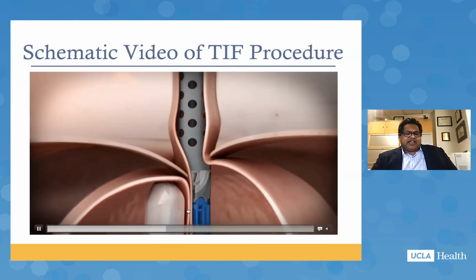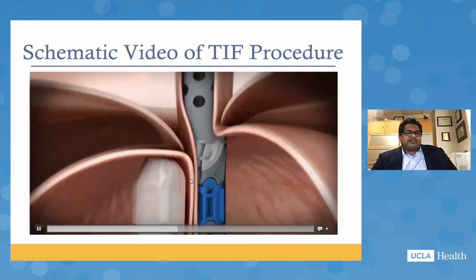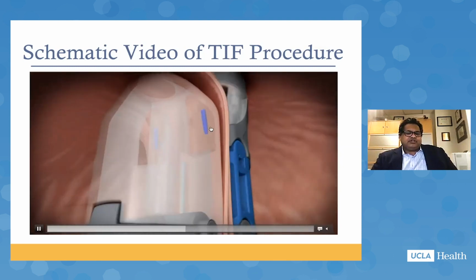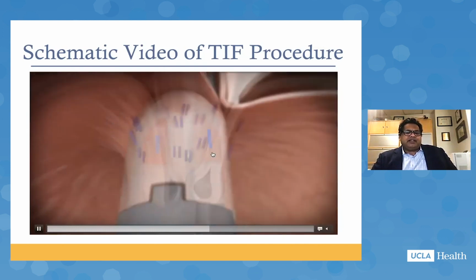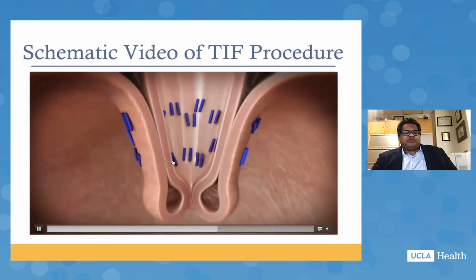And this again is a gastroesophageal plication. And the idea is you're trying to create a significant amount of intra-abdominal esophagus here. So you can see that you do this. And then you have these 2 serosal fasteners here that are deployed. So with each one, and this has been automated in the most recent version, so you can do this relatively quickly. So once you've approximated this, then you release, and then you keep going around as you do this until you do the 270.